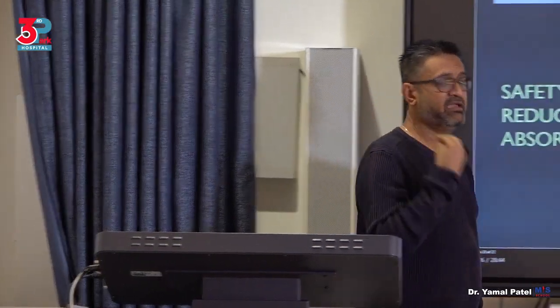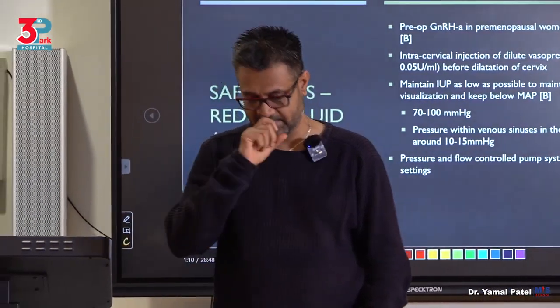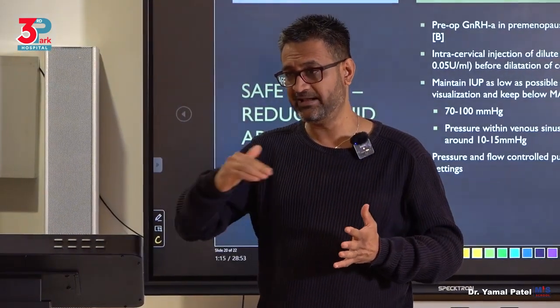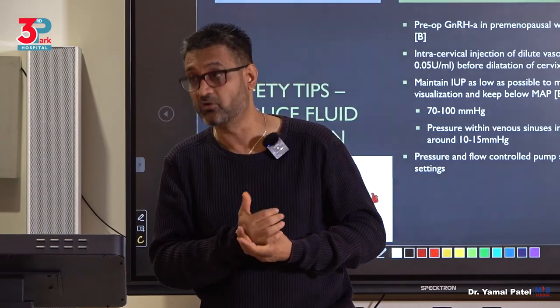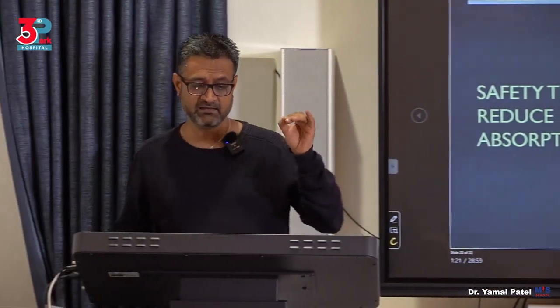Use of intracervical injection of very dilute vasopressin. You have to be very, very careful with this. This thing can cause a sudden cardiac arrest. It'll cause bradycardia and cardiac arrest if you're not careful. It has caused this many times in many people's cases. So learn how to use the vasopressin if you ever have to use it, okay?